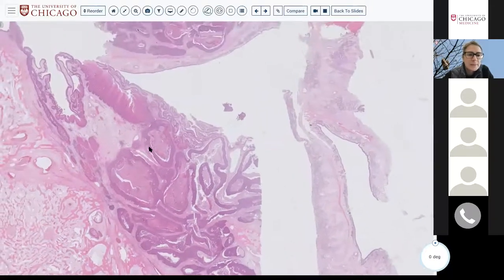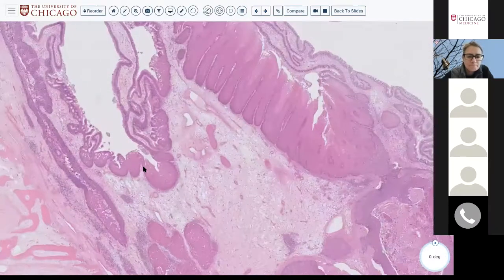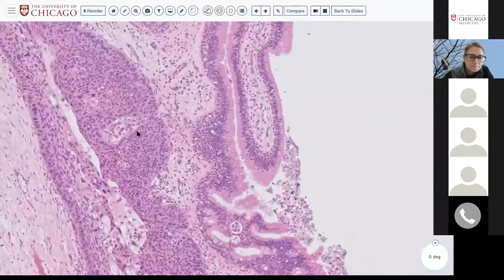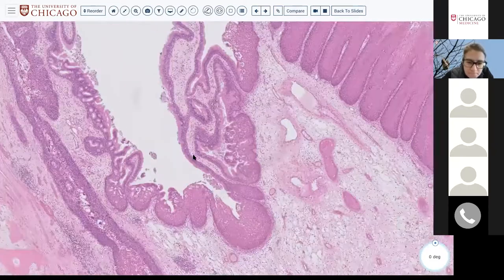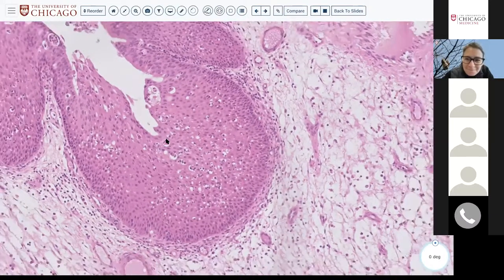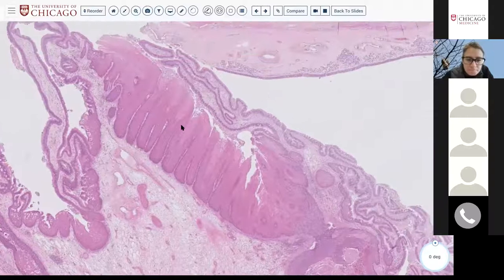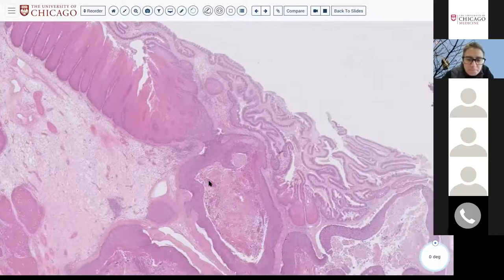Okay, so here, as you said before, we have both respiratory epithelium, but then there's also a very thick squamous epithelium as well. And when you look at it, I see some infiltrating neutrophils there, and it does look acanthotic, or thickened. And when we look at the architecture of the entire lesion, it looks really thick.